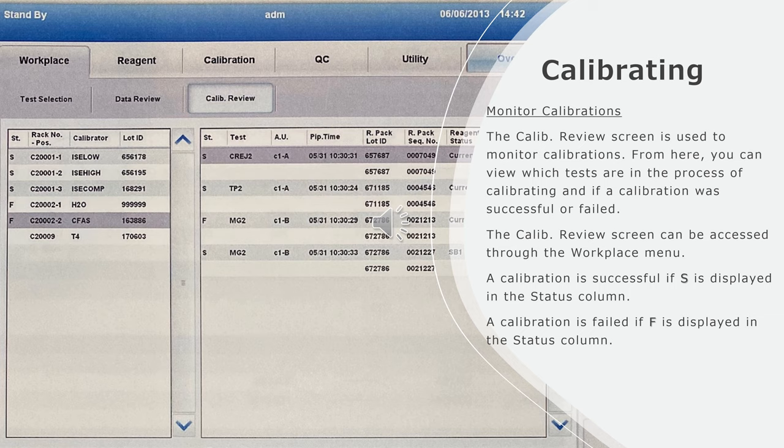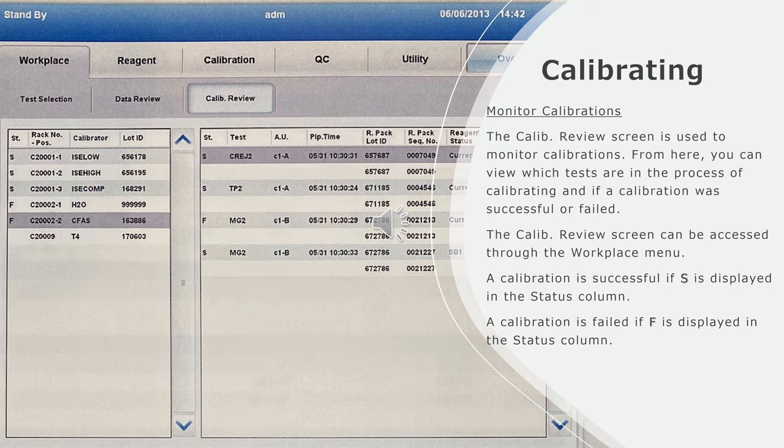The calibration review screen can be accessed through the workplace menu. A calibration is successful if S is displayed in the status column. A calibration is failed if F is displayed in the status column.